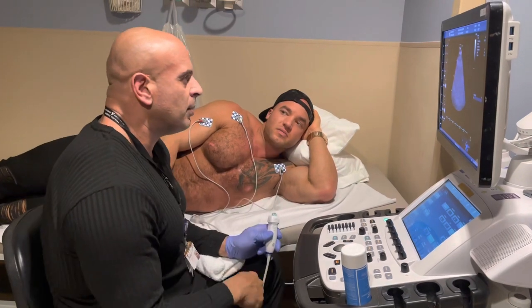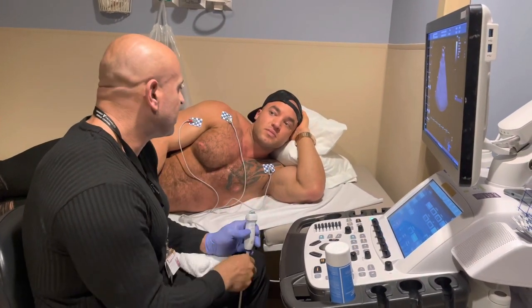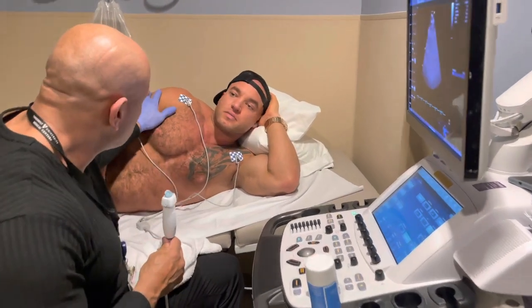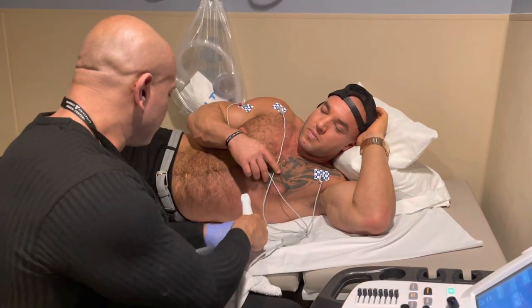So 1.2 is normal, and yours is 1.3. I've seen it go up to 1.7 — mine is just genetically like that. Now I'm going to go to your side so we can see the entire heart. I'm going to lean you back a little.